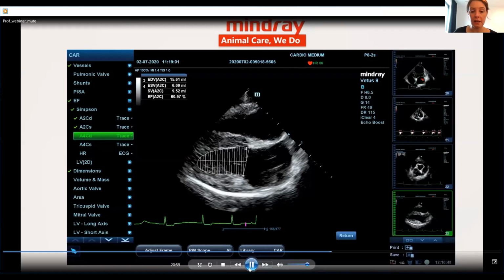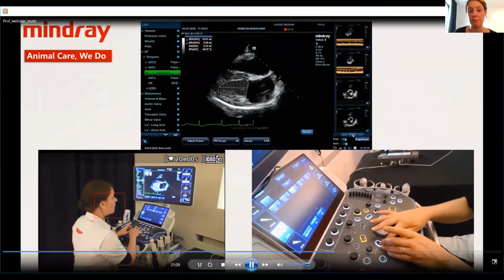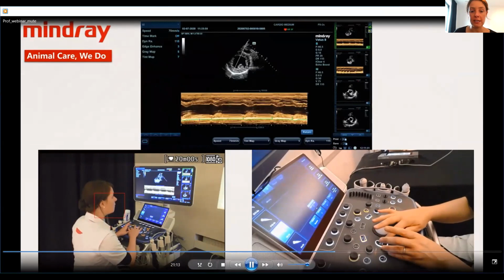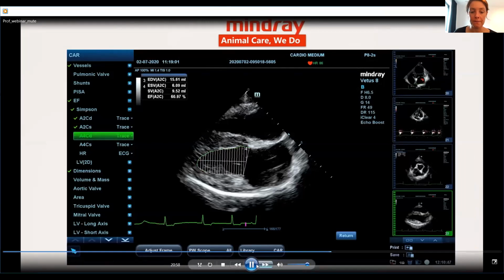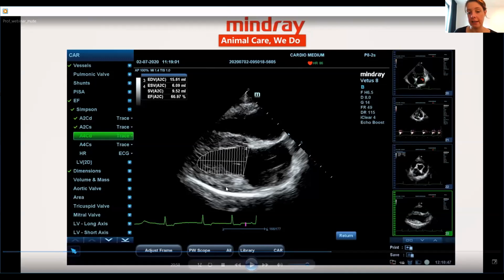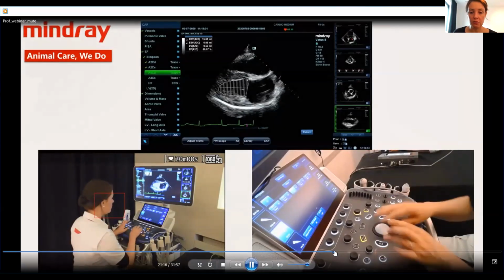Okay, so that is the left ventricular volume in diastole and systole, and the method that we use is the Simpson's method of discs. So what you see here actually is, I will maybe explain it just briefly before we go on to the M-mode image, that the machine actually divides the left ventricular cavity in several discs, and the machine makes a summation of all of these discs and calculates the volume based on that. So it's in your machine, it is also marked under Simpson measurements. Okay, so already a little bit more of an advanced measurement to start with.